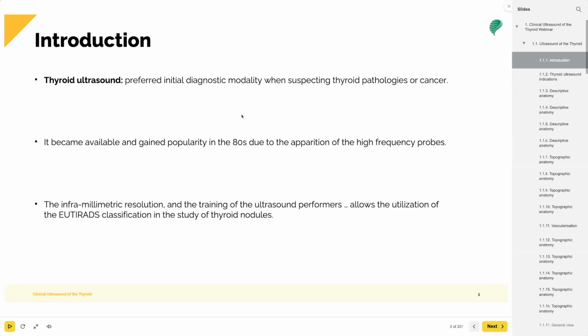So we can have visual enlargement, we can palpate enlargement. Ultrasound is very popular as an exam that is done initially to diagnose because of the low costs. Also, it is very minimally invasive.